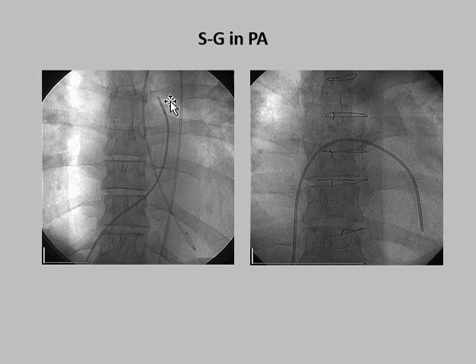You can see the balloon in the pulmonary artery in different anatomical sites in different patients. You can see that the pulmonary artery can be in different locations depending on where the catheter falls, either by accident or design.